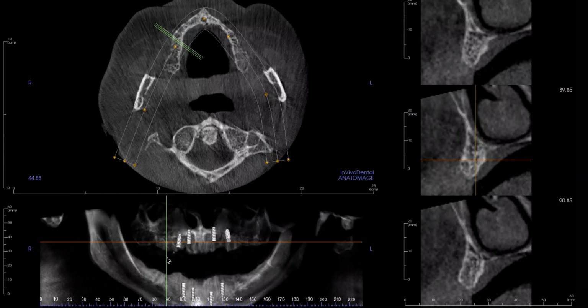Where you can. The all-on-4 concept was invented as a graftless solution for an upper and lower fixed prosthesis. Graftless meaning it's sometimes difficult to do large grafts to get enough bone to place implants. There's a large amount of time and money associated with that. So the all-on-4 concept is the idea of tilting the posterior implants so that you can avoid the maxillary sinus, and on the lower arch, the mental foramen or foramina, to get as far back as you can without grafting.